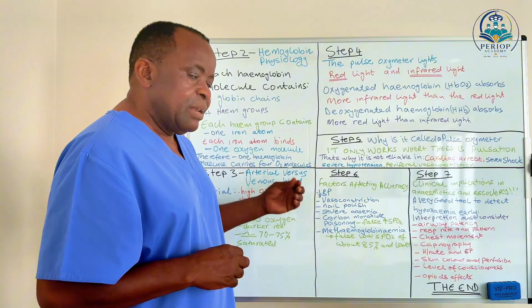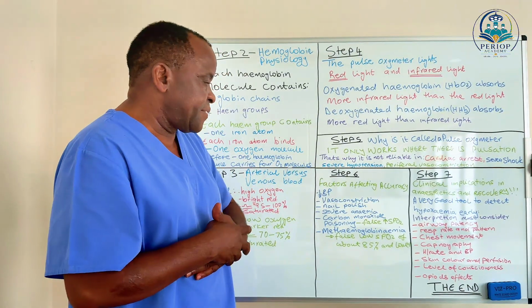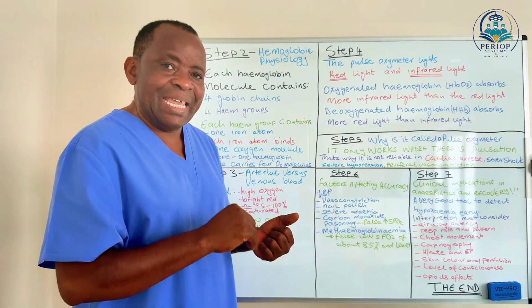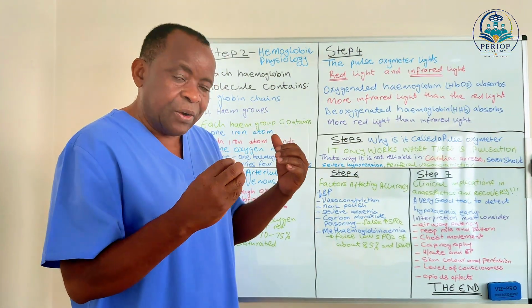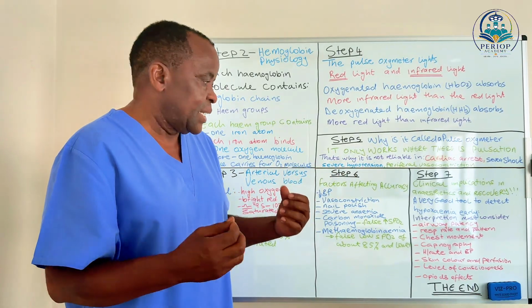And with patients with artifacts, patients who have nail polish or artificial nails, the light has challenges in penetrating through those artificial artifacts.